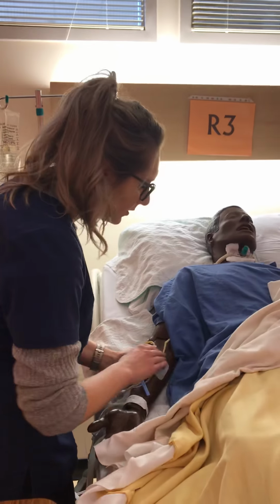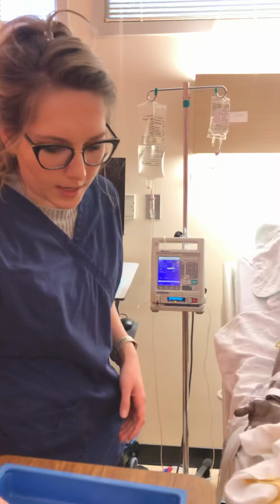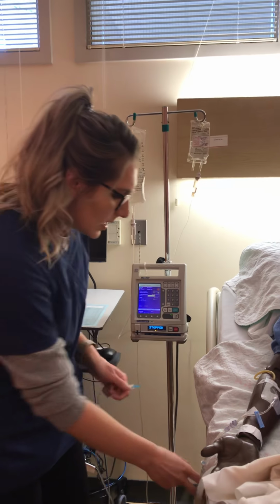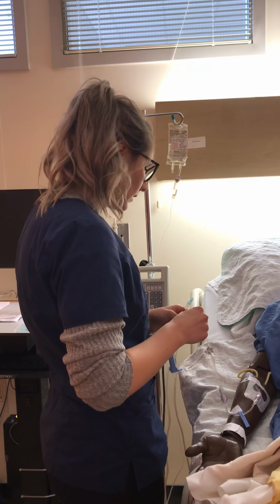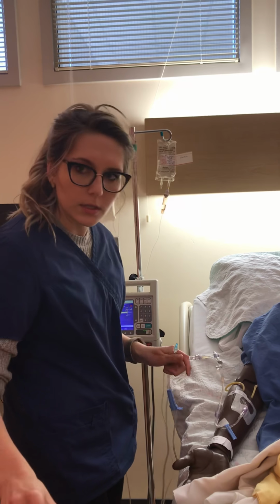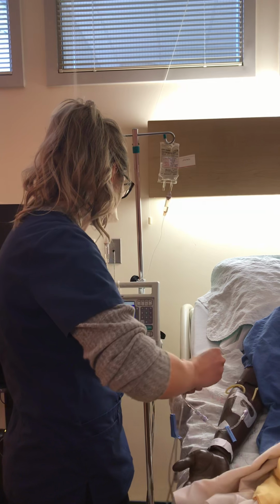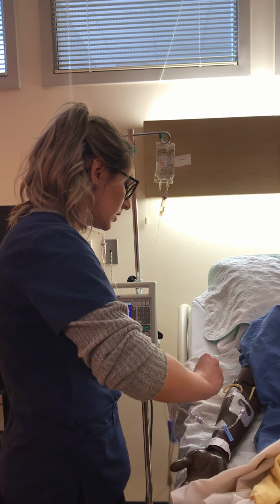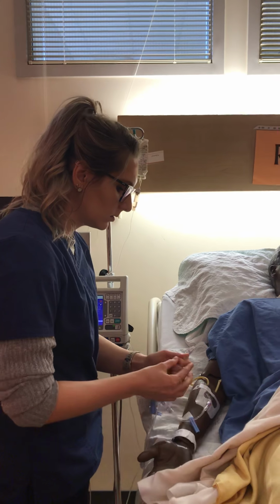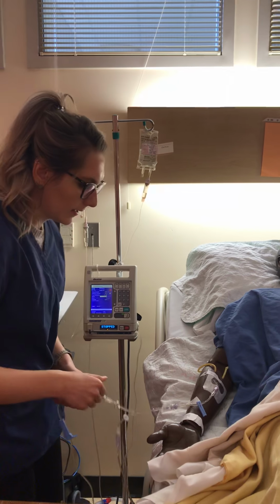I'm just going to assess the site. There is no signs of infiltration, swelling, or redness at the site, and they're not experiencing any pain. So to be safe, I'm just going to grab this here, and I'm going to swab. Okay, third check is done with my second nurse. So I'm swabbing for 30, allowing to dry for 15, maintaining sterility, and I'm just attaching. I'm not starting anything yet.